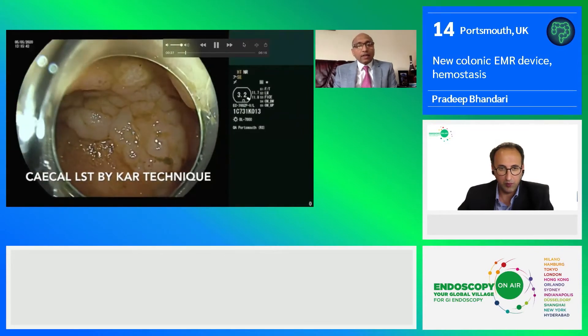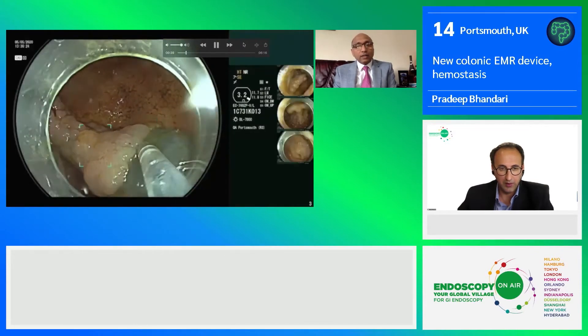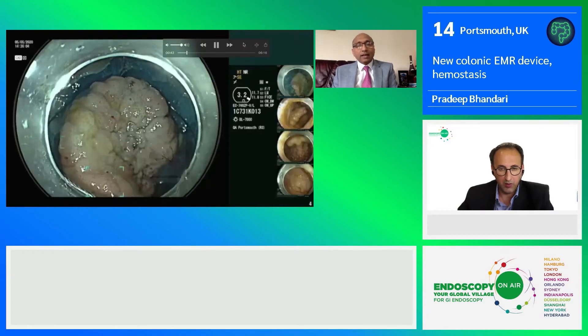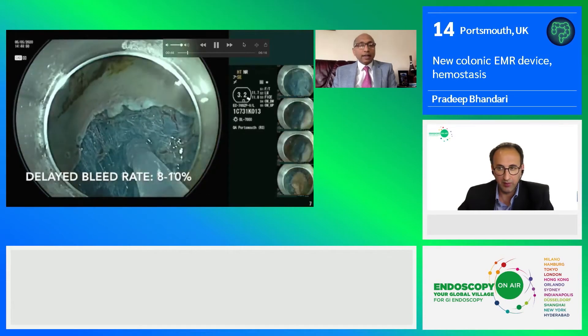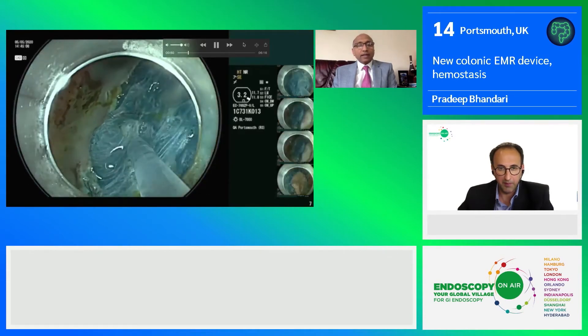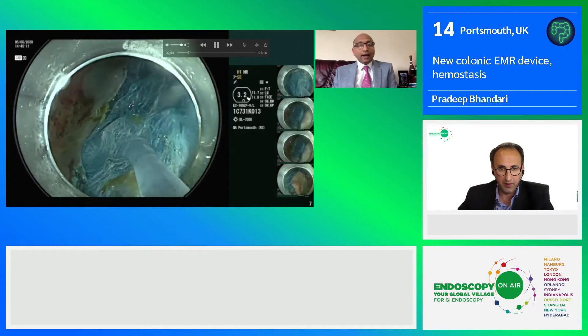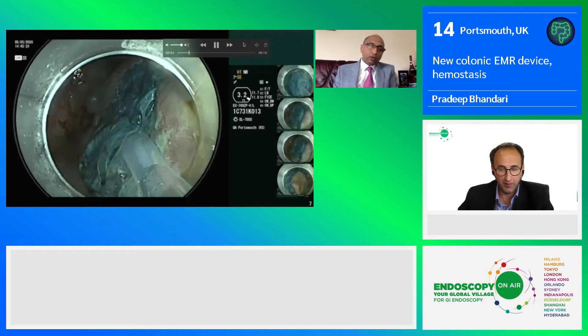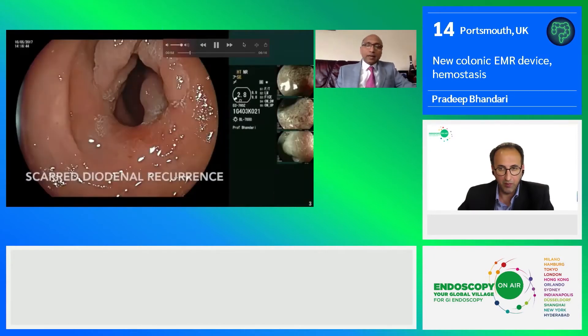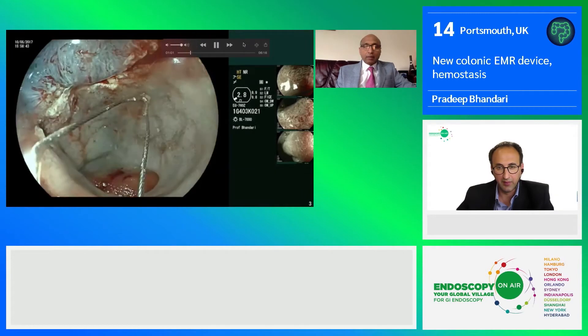Another challenging case of a cecal LST. As we are aware, cecal LSTs do cause delayed bleed — almost eight to ten percent. We resected it by EMR and instead of putting clips, we used PuraStat. It stops bleeding and can also help in prevention of delayed bleed.